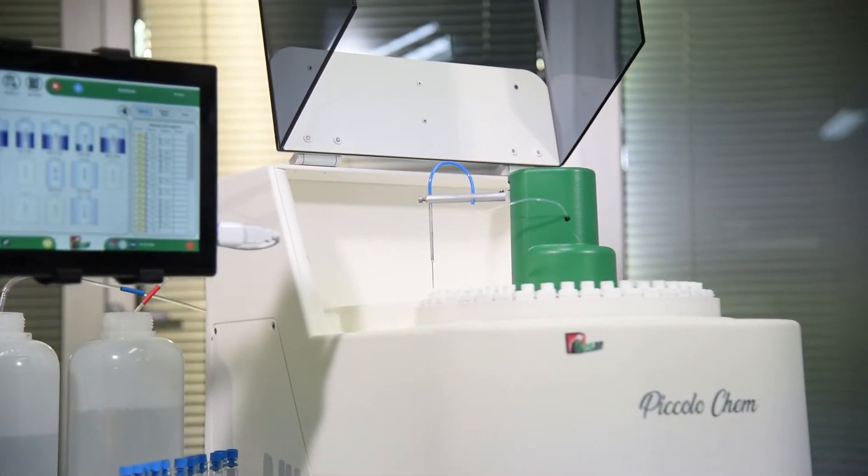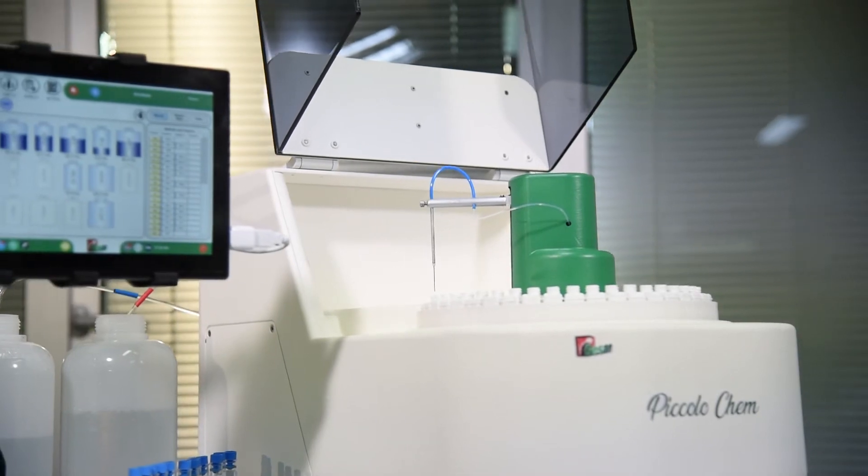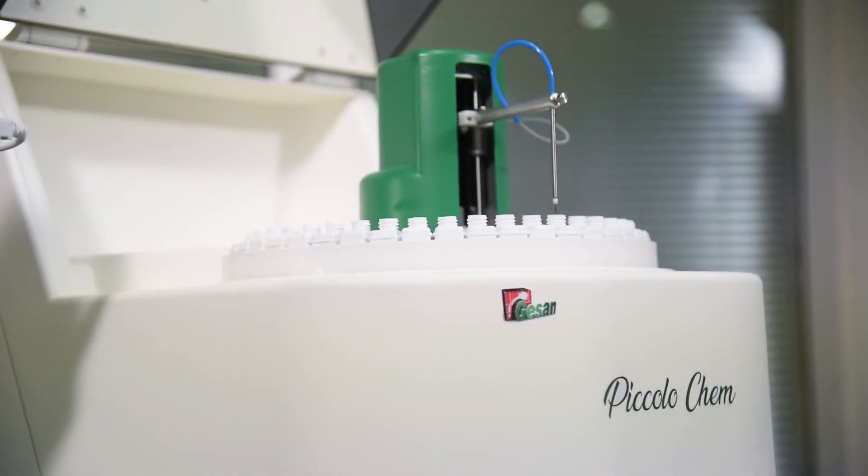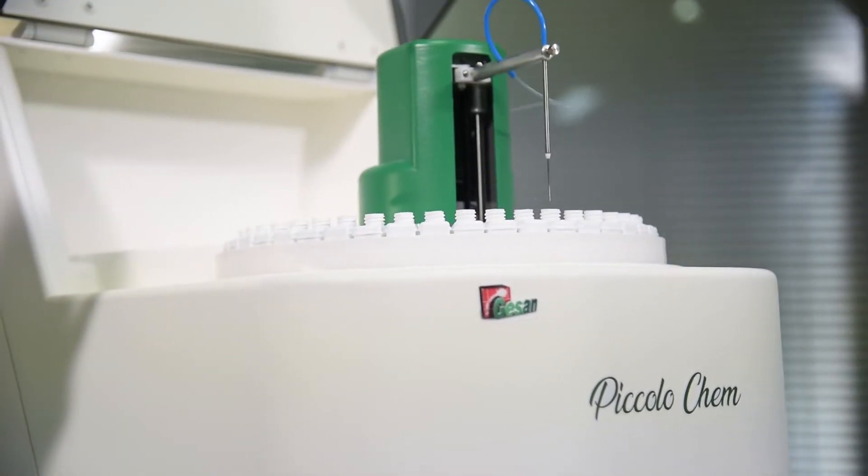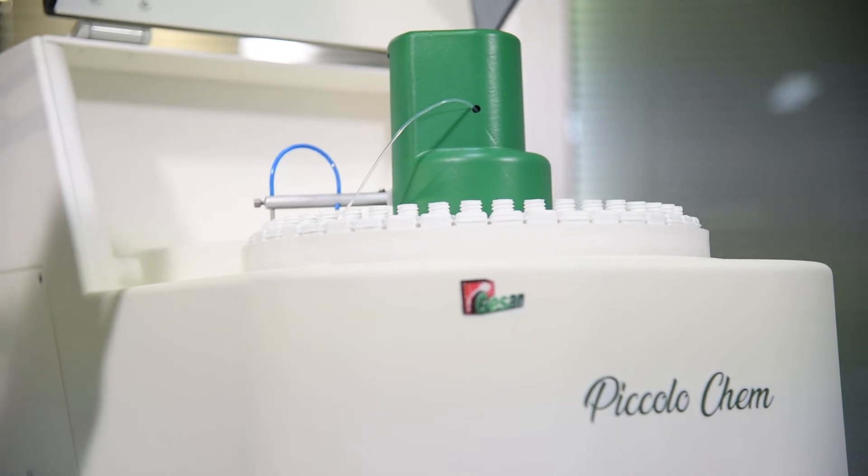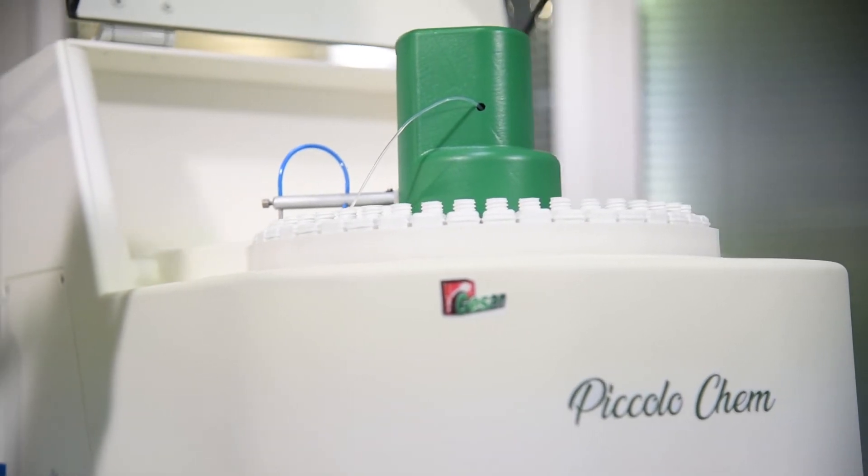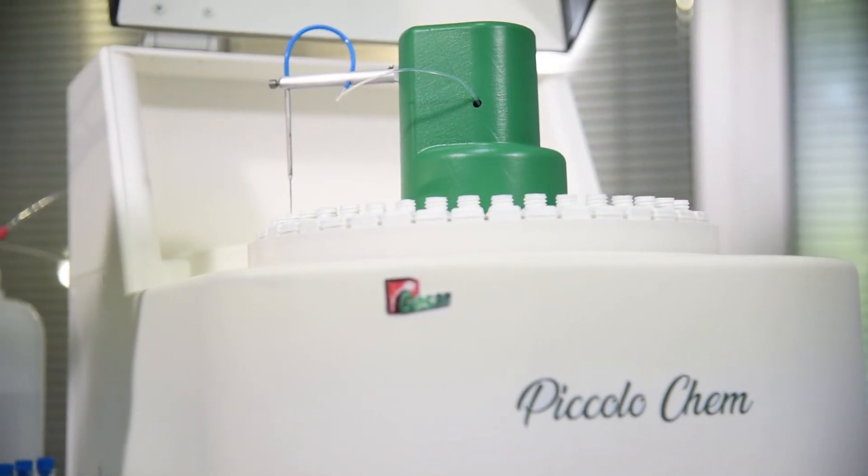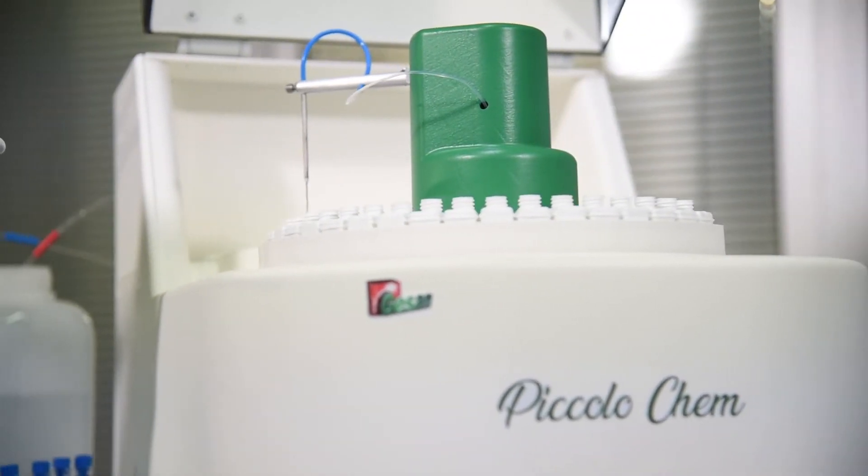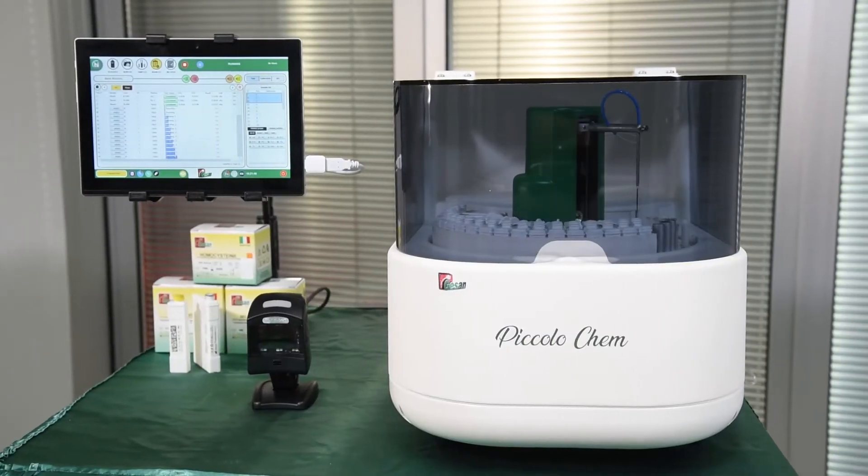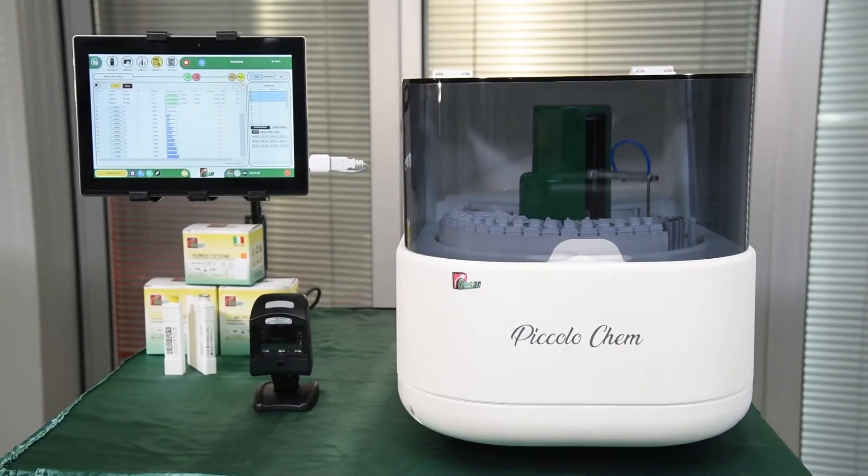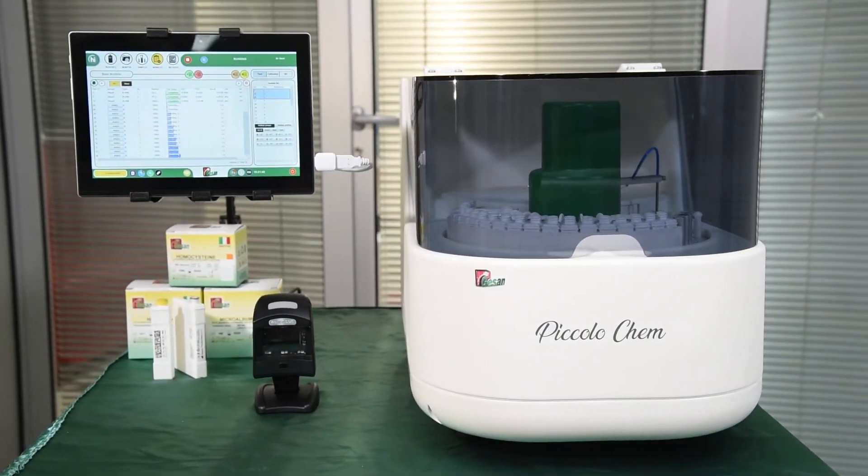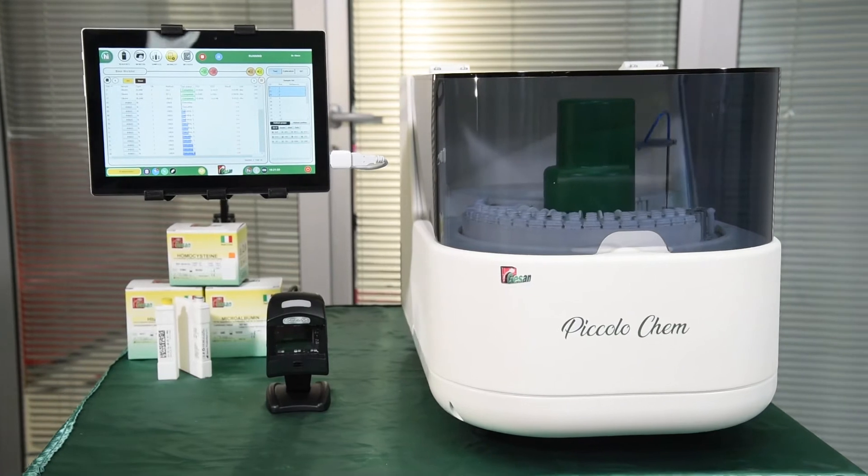Ideal for daily routine and special routine. Its weight is just 19 kg and it can perform up to 150 tests per hour. Piccolo CHEM is suggested for clinical chemistry and turbidimetry.